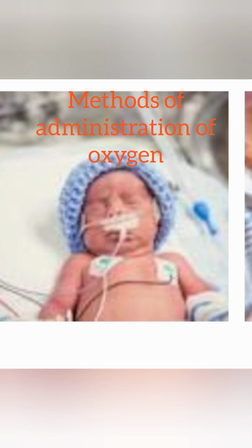Coming to the methods of administration of oxygen. So, one is nasal catheter, second is oxygen by mask, third is oxygen tent, and fourth is oxygen hood. Fifth is incubator. These 5 methods of administration of oxygen can be used according to the child's sickness condition and doctor's advice. Now we will see first nasal catheter, how to administer oxygen in that.